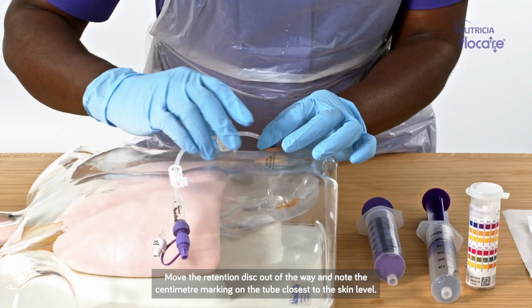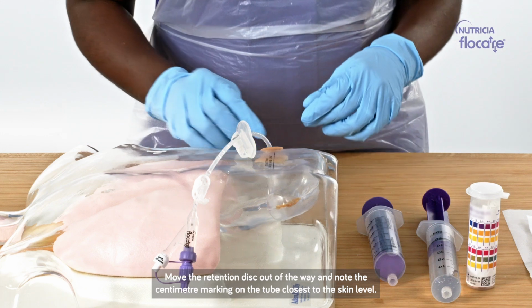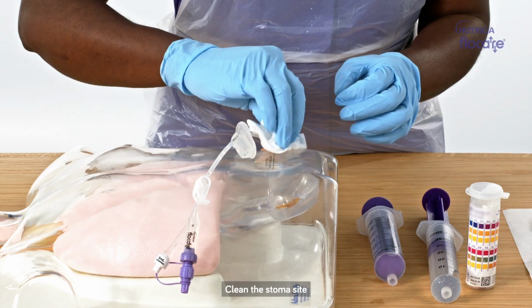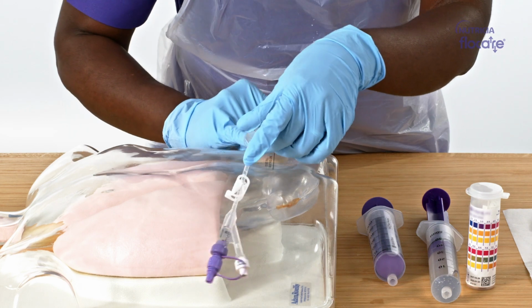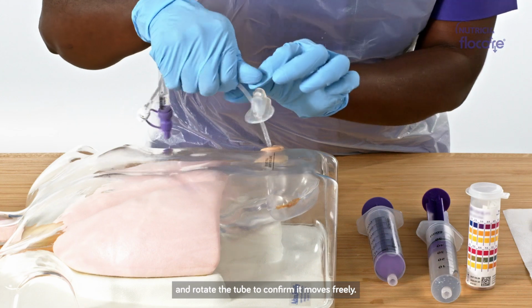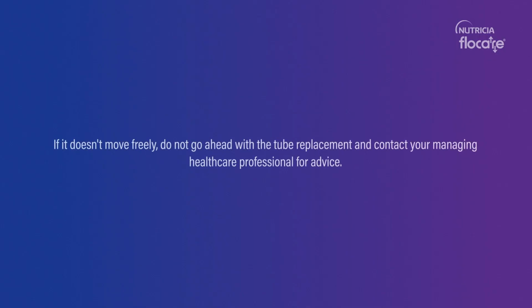Move the retention disc out of the way and note the centimeter marking on the tube closest to the skin level. Clean the stoma site and apply lubricating gel to the stoma tract. Rotate the tube to confirm it moves freely. If it doesn't move freely, do not go ahead with the tube replacement and contact your managing healthcare professional for advice.